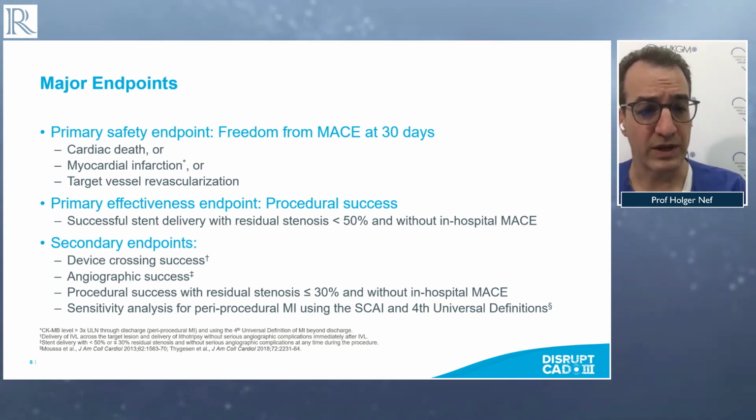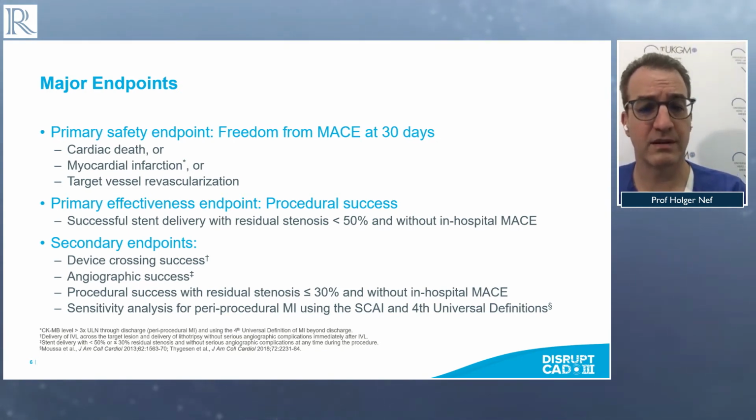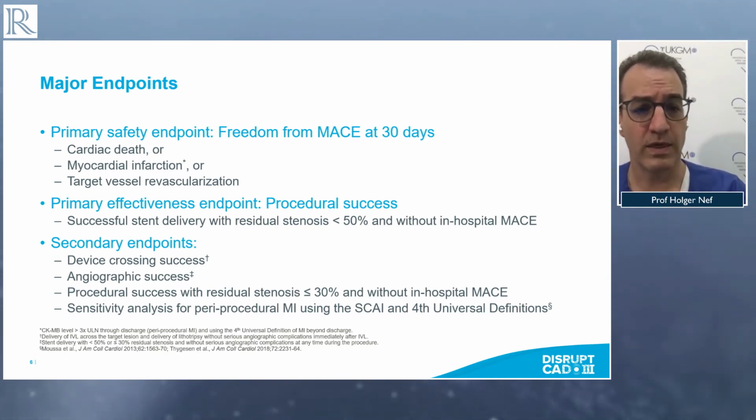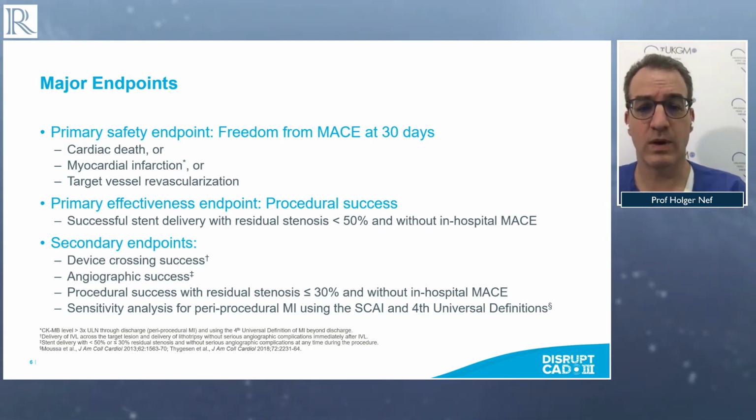And there was a primary effectiveness endpoint of procedural success, meaning a successful stent delivery with residual stenosis below 50% and without in-hospital MACE.